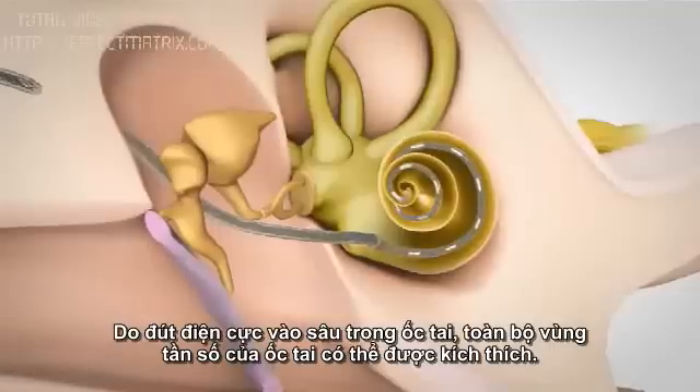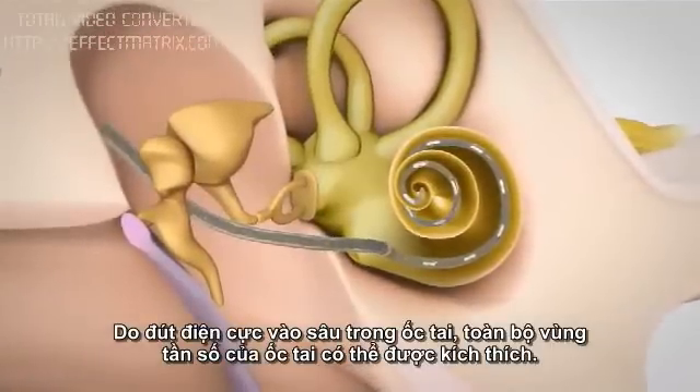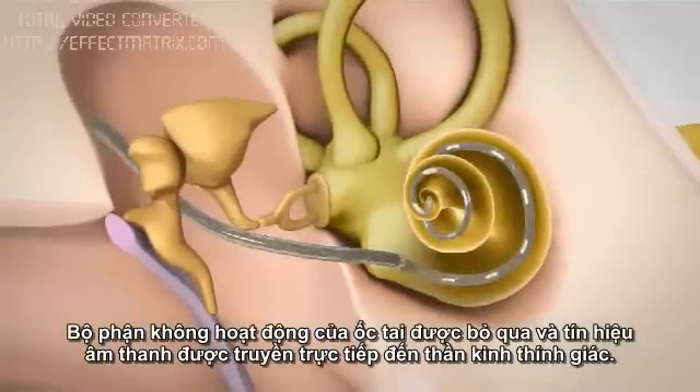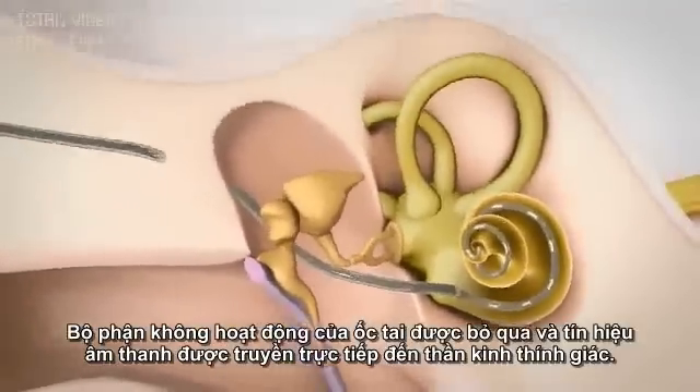By inserting an electrode deep into the cochlea, the entire frequency range of the cochlea can be stimulated. The non-functioning part of the cochlea is bypassed, and the sound signal is directly passed onto the hearing nerve.